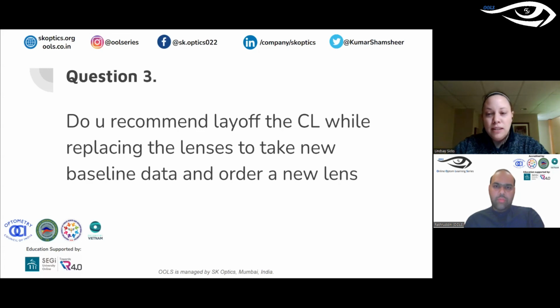And if the lens treatment needs to be changed, we don't necessarily have to de-adapt them just to see what their refraction is, which might be what the parent thinks needs to happen. So there's very few scenarios, I think, where that's necessary. One other thing that comes to mind might be if you're changing lens designs, like if you're not getting the appropriate myopia management or even appropriate treatment that you're expecting with one design, before you go jump to another design, you may find that the lab will request that you de-adapt the patient and start over. That's not always the case, but it might be.